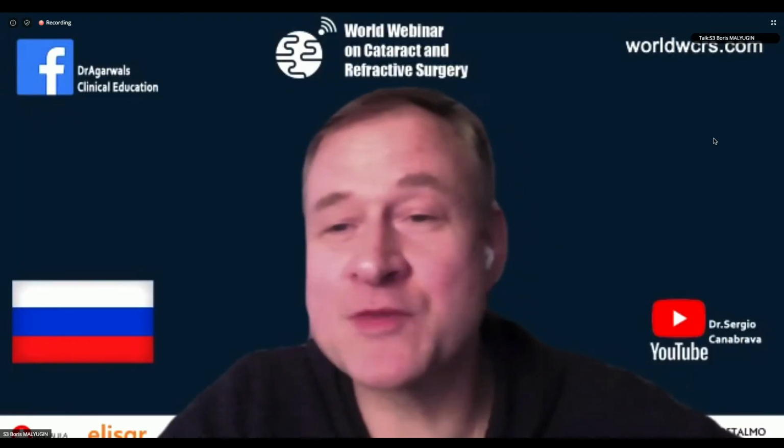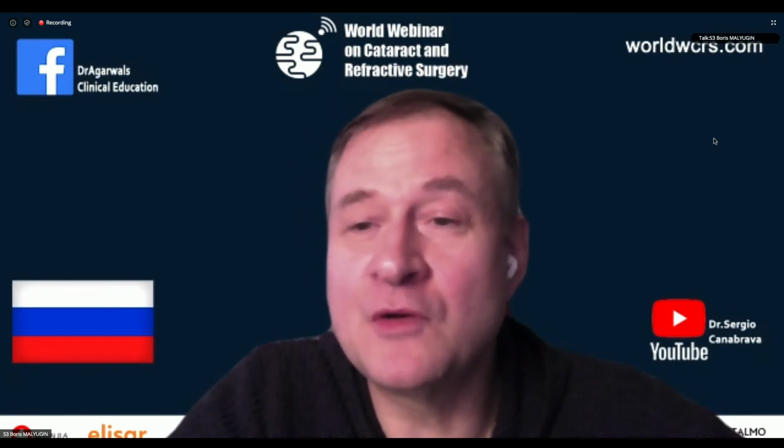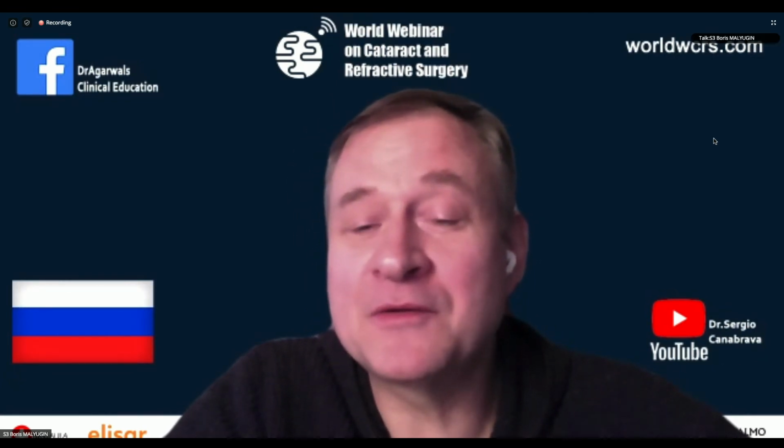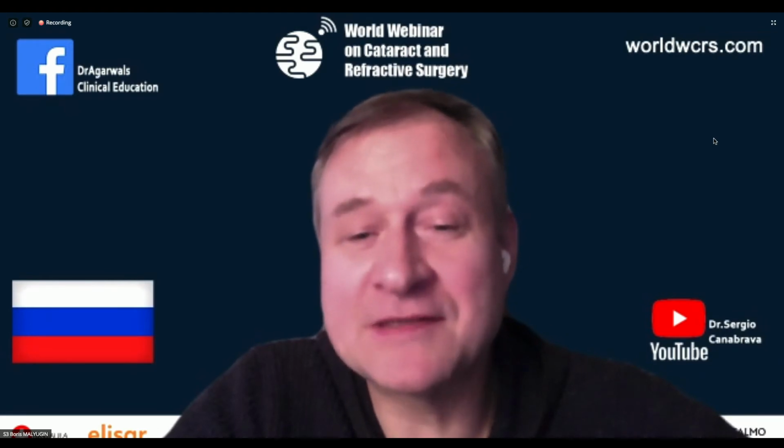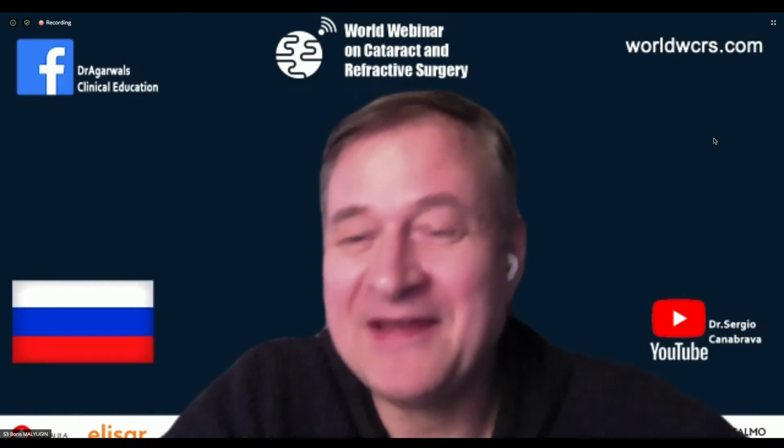Okay, because I do have some experience with a different ring, but also with femto. So my usual technique, I leave viscoelastic. I use dispersive viscoelastic, and I leave it in the anterior chamber.